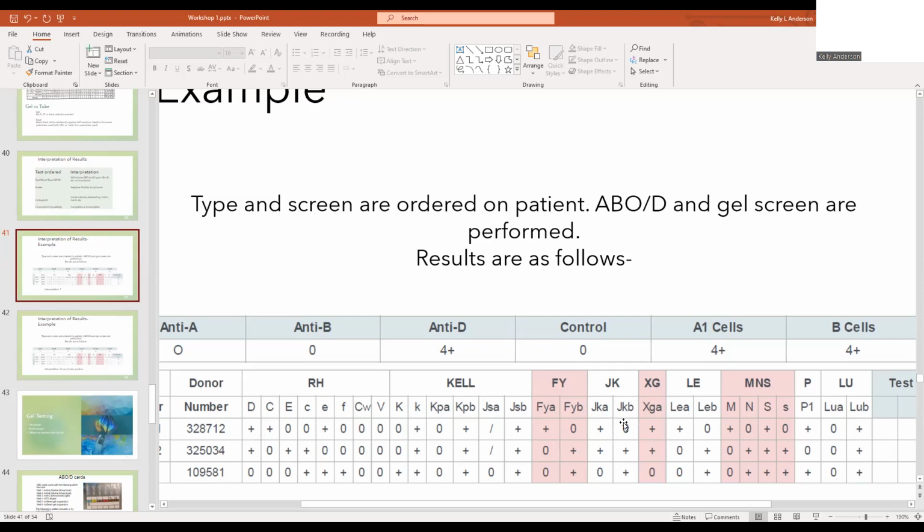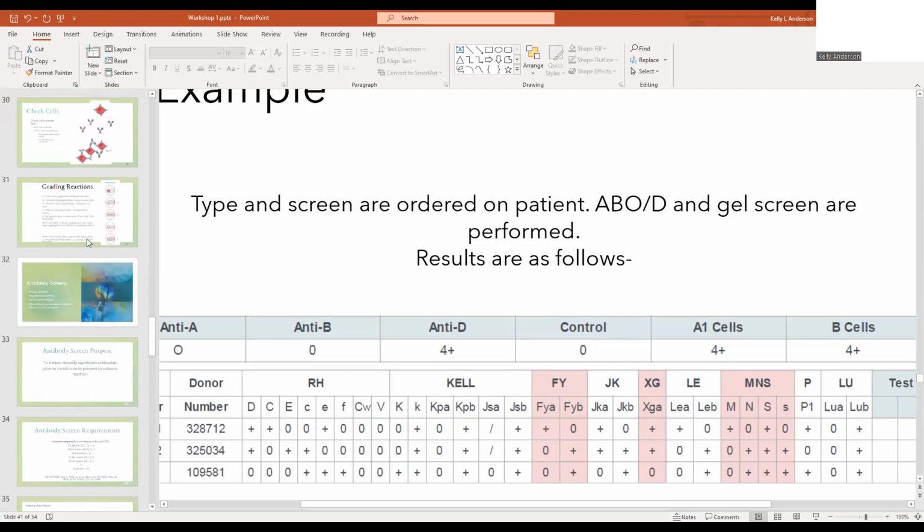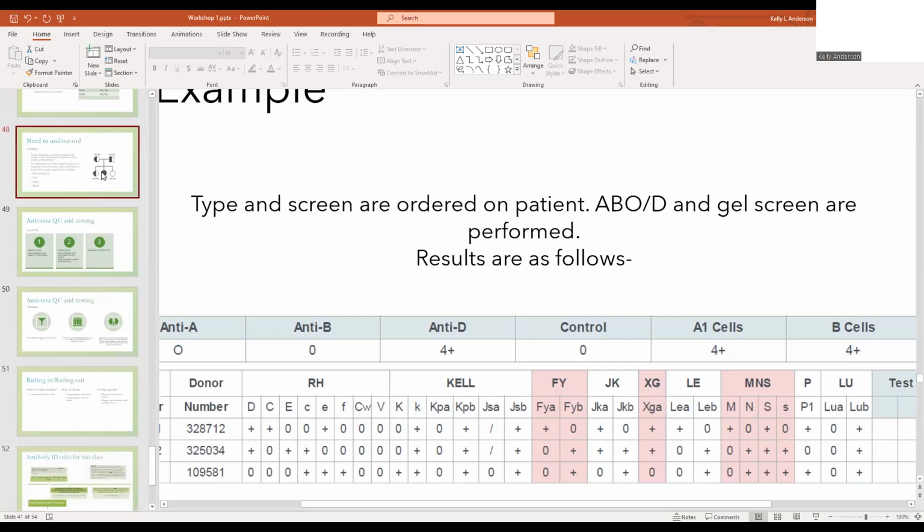For my positive control, I want to use the cell that's going to have the weakest expression of JKB. That's going to be one that is heterozygous. So cell 3, because they're JKA negative, they're homozygous, so they're going to have extra JKB. So I want to use cell 2 because they're going to have less JKB. So looking back at this, sorry, zygosity.